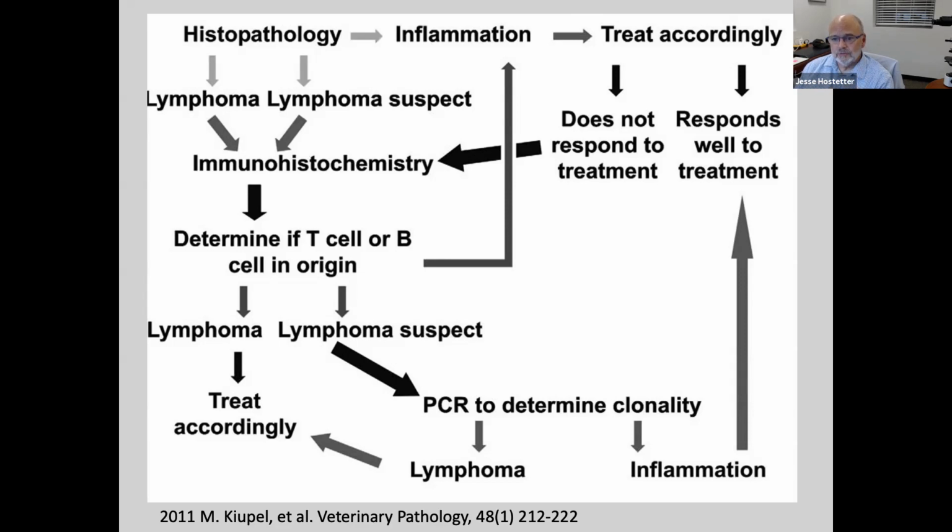I think I answered Isabel's question about crypto. I've got a question: I've seen a remarkable increase in intraepithelial lymphocytes with intestinal cryptosporidiosis in a leopard gecko before. I had a mast cell infiltrate. So that's really helpful. I suspect too in that case that it was related to the crypto, especially since there were so many plasma cells there. It looked very inflamed to me.